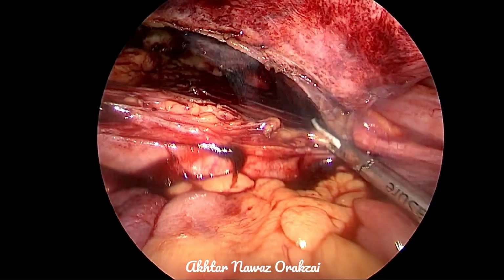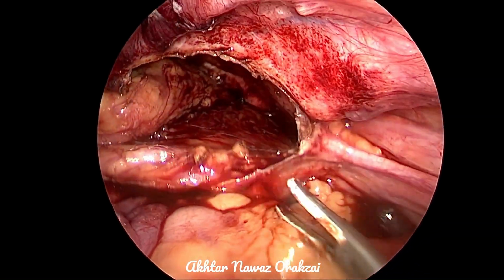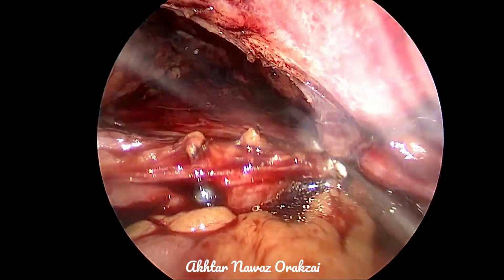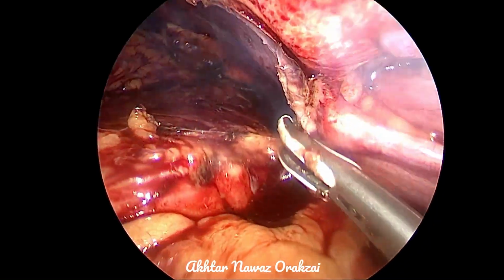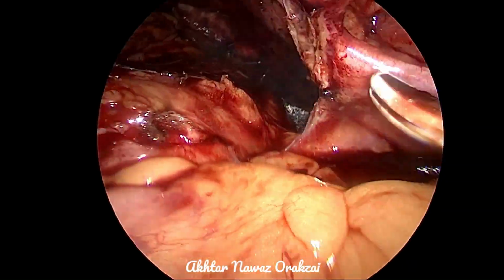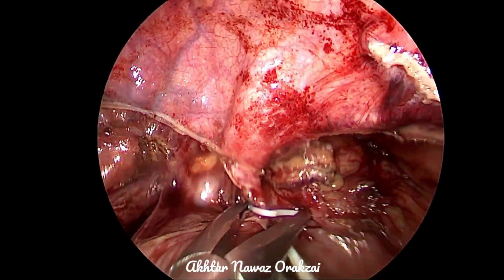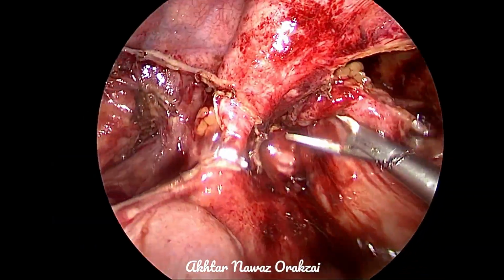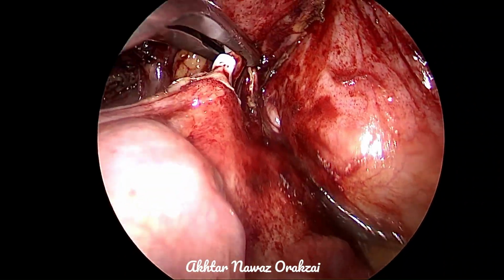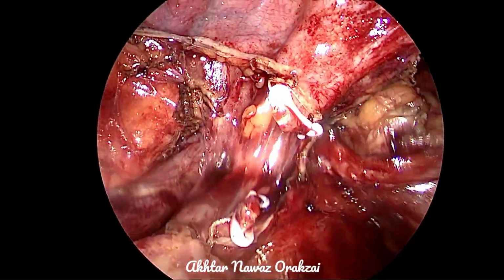Here you can see that these fibers are restricting the mobilization of the bladder, and it cannot reach up to the psoas muscle. So these attachments are also mobilized slowly and gradually, keeping in view the various structures. This round ligament is coming into our way, so we are clipping it, and then we will cut it between the clips so that it gives way to the bladder.